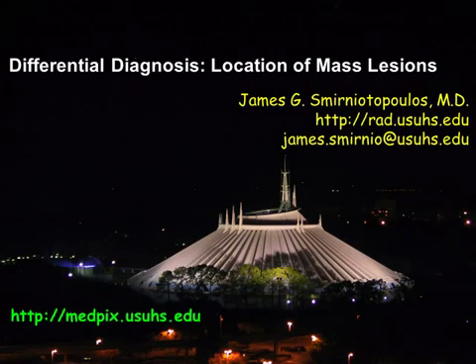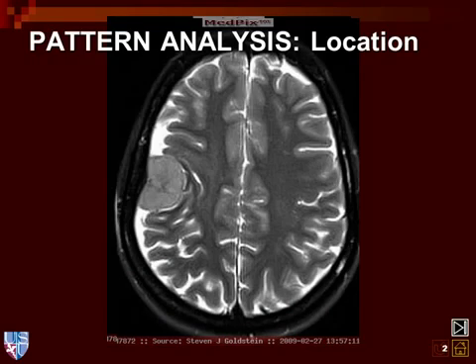In this short tutorial, we will discuss the introduction to differential diagnosis by location. Neuroradiology is very much like real estate, and the three most important rules for both real estate and neuroradiology are location, location, and location.